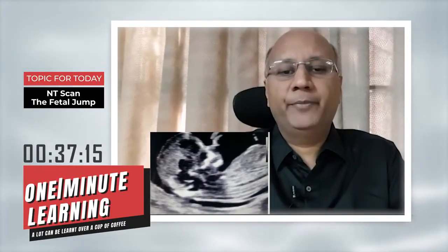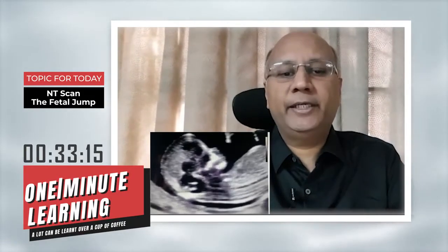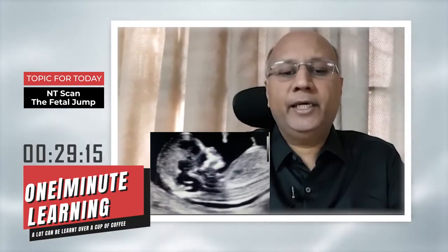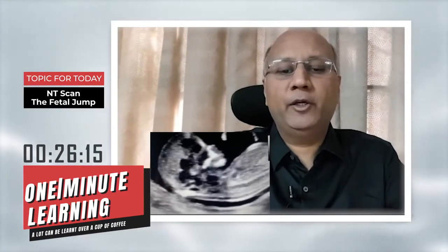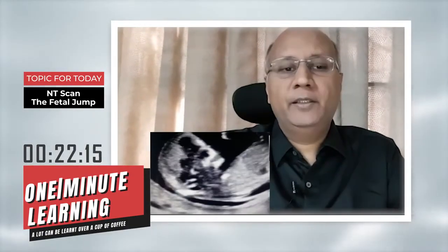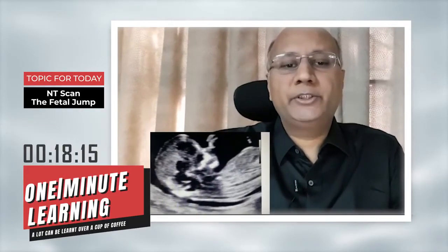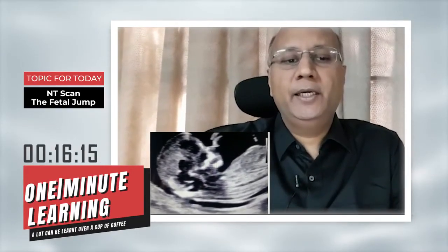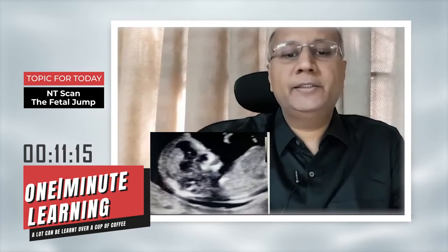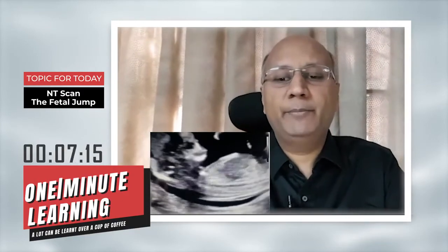After you get the right view, wait for some time and the fetus will take a jump. When it actually takes a jump, you can see that the skin moves away from the amnion, and the real nuchal translucency can be measured. The fetal jump is an important observation to be done while measuring nuchal translucency, in order not to wrongly measure the NT as the anechoic space behind the skin of the fetus and the posterior amnion, which is actually amniotic fluid.